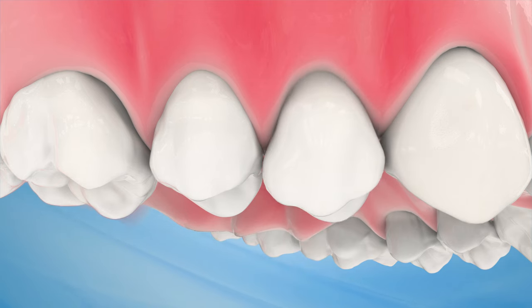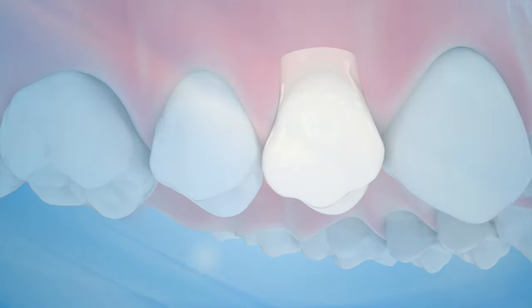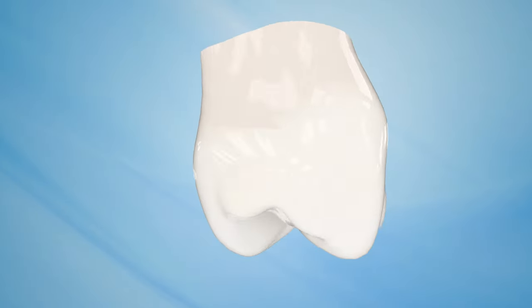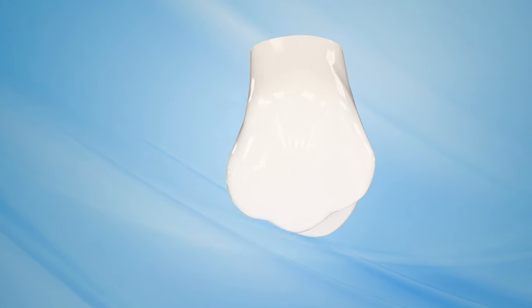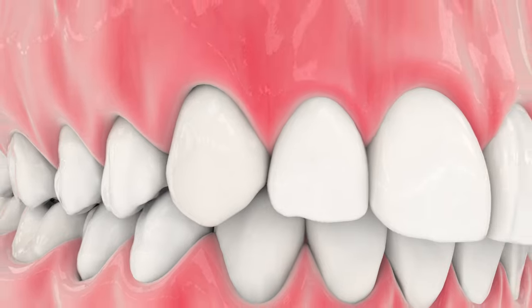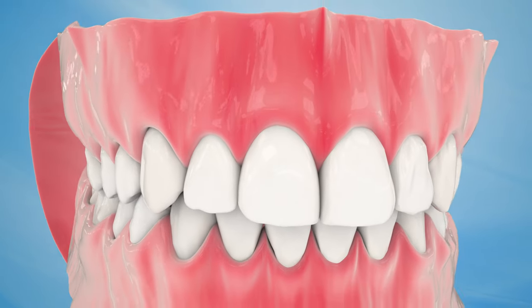Finally, the new replacement tooth is attached to the dental implant. For a single tooth implant, your dentist and dental lab will customize a new tooth for you, called a dental crown. This crown will be created to naturally blend with your smile, based on size, shape, color and fit.